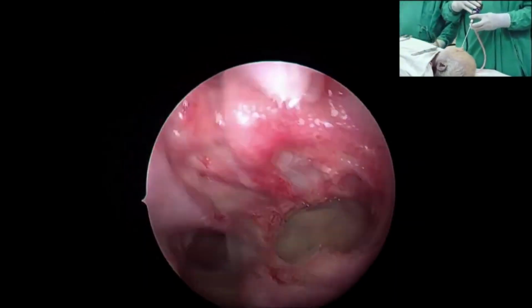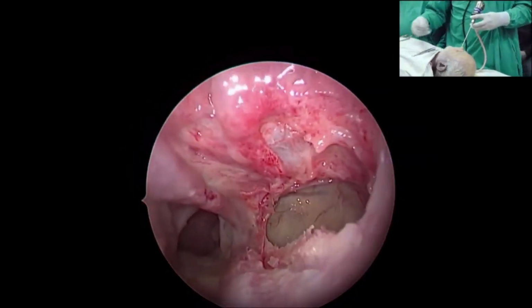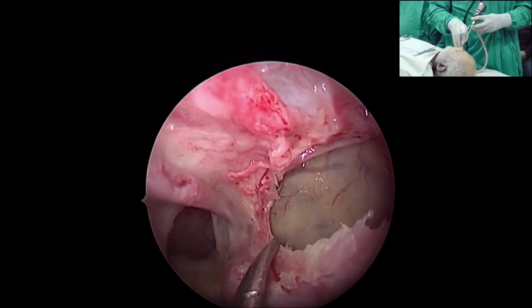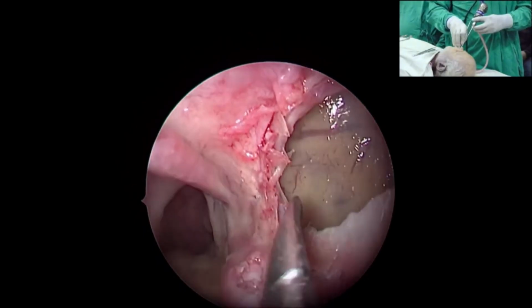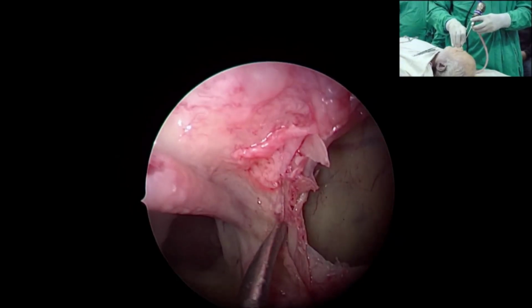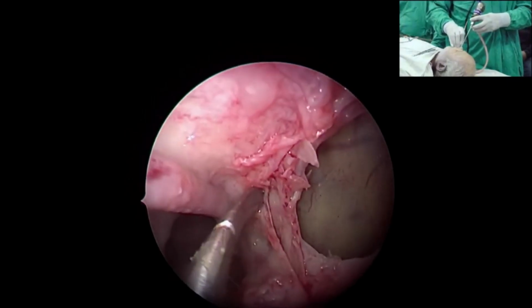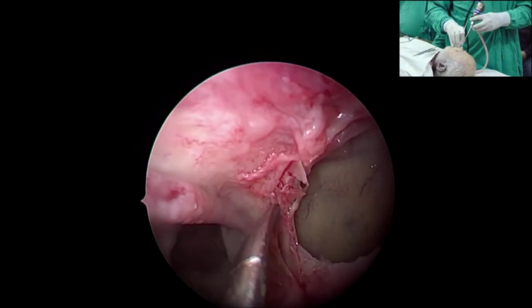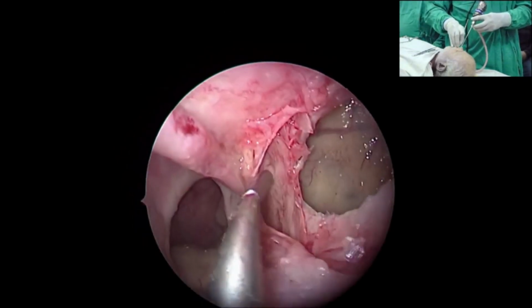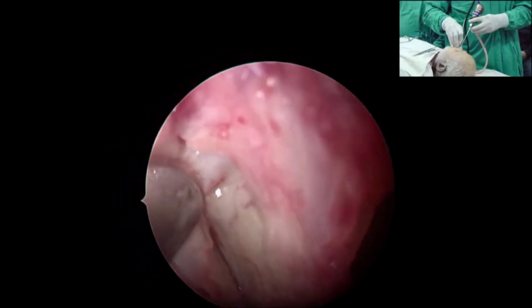Here, at this point, we must be careful about certain things. Though I will come later in detail about the anatomy in this region, here I need to point out certain issues. See this? The posterior part of this bone. This is the palatine bone. Can you see this? This is the palatine bone, and see posteriorly the attachment of the middle turbinate. See this?